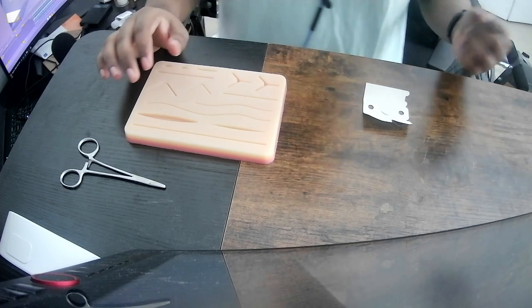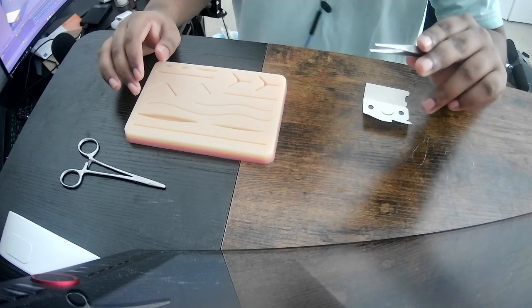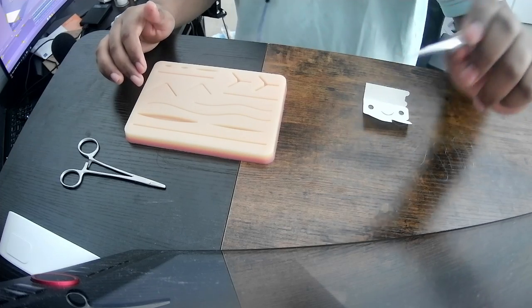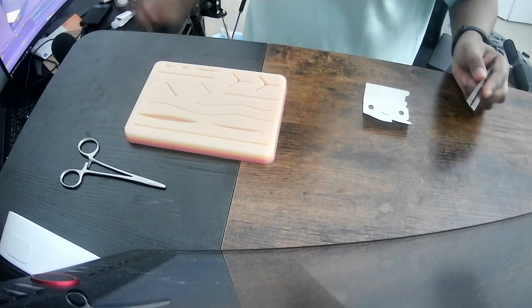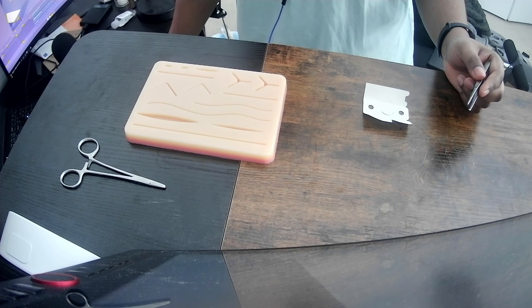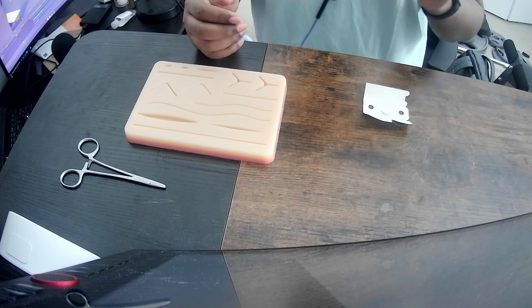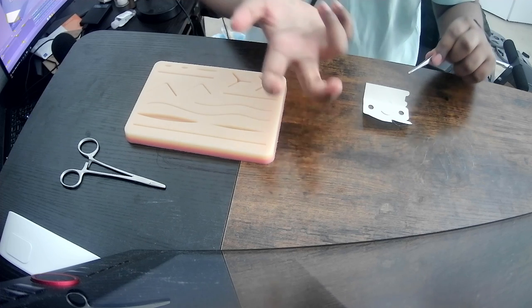Okay, let's try to, I guess, load the needle, as they say. So I'll be attempting to hold the needle with just this, Addison's forceps. As I mentioned, they're the teeth. Let's see. Let me just watch the video. And where on this curved pattern, Addison forceps. And this is where knowing where the double notched side is. I think the double notch side goes underneath. Let's say so you hold it like this.